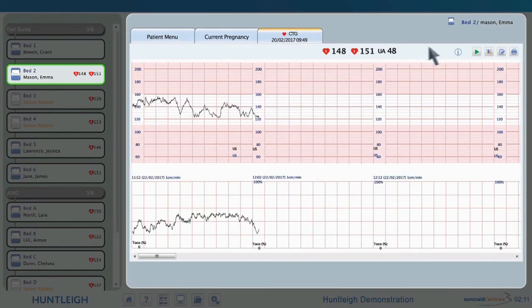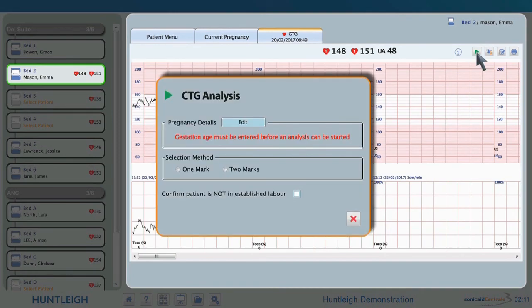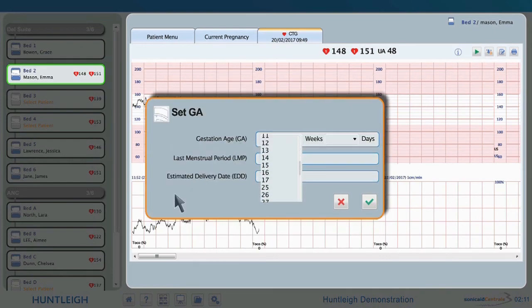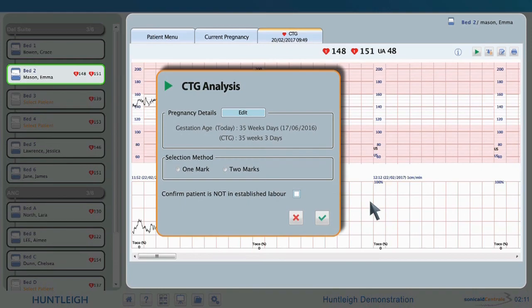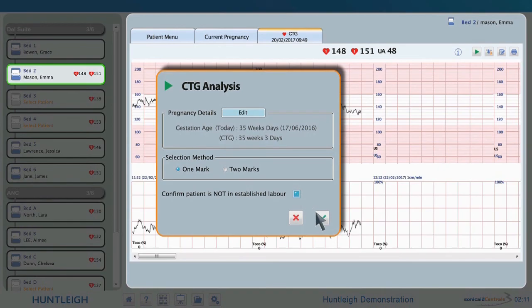Back to the CTG trace — by clicking on the green triangle, the Dawes-Redmond analysis can be started, first by entering the gestational age if it has not been entered before. The gestational age can also be calculated by EDD or LMP, and automatically updates over time, so only needs to be entered once per pregnancy. Select one mark to start the analysis at a particular point on a trace, or two marks to analyse a section of a trace greater than 10 minutes long, and confirm the mother is not in active labour.